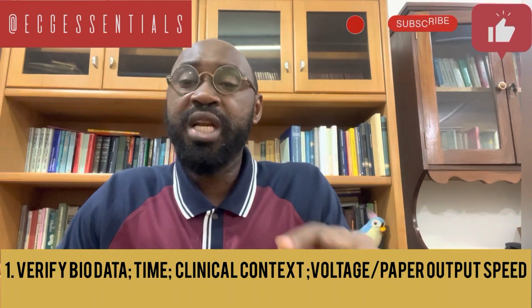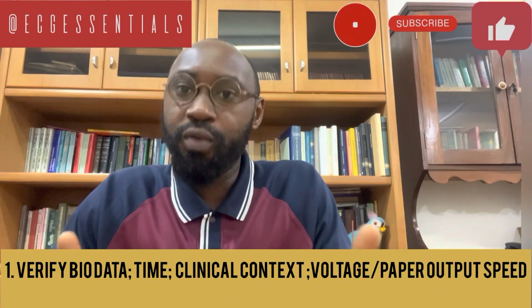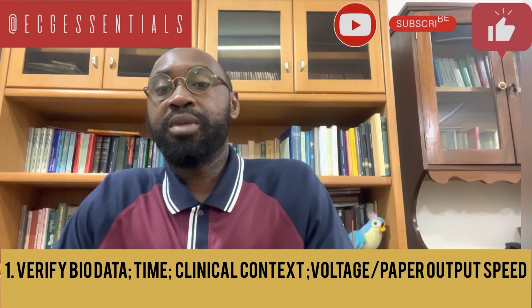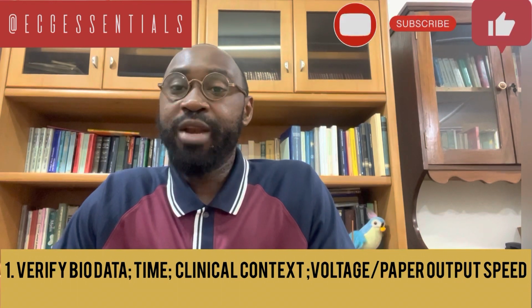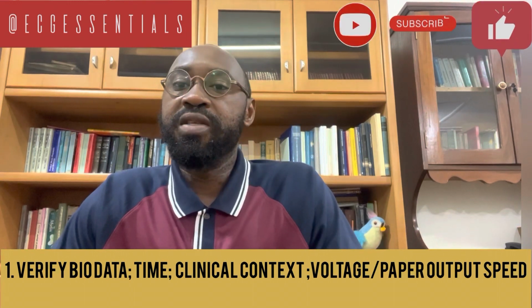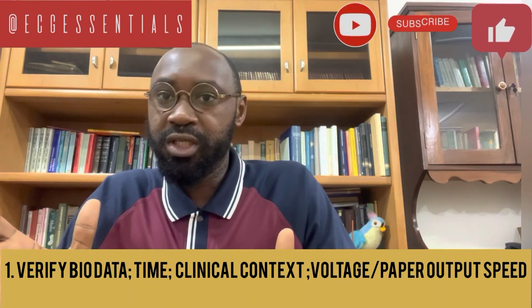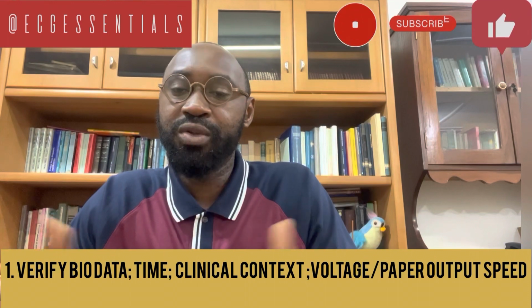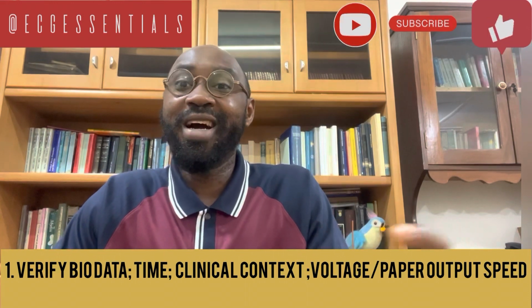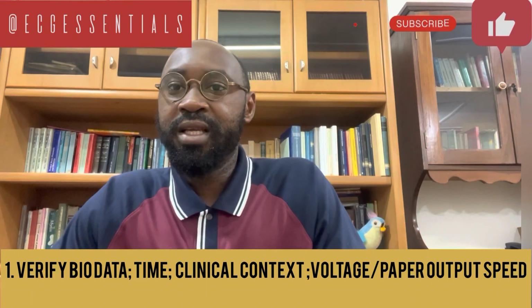And so if you are reading the ECG, then you have to be mindful of which speed the paper is recorded at. We have mentioned that this information is captured on the ECG paper, including the speed and the voltage. If for any reason at all we do not find them there, then the calibration marker that we find on the paper should be a guide in appreciating the voltage and the paper output speed.